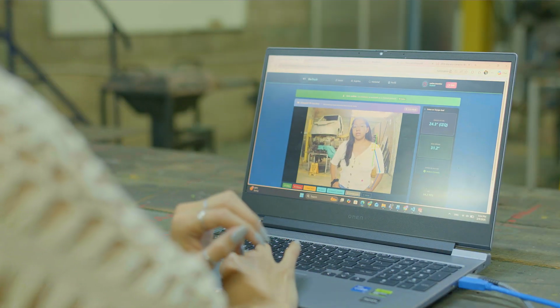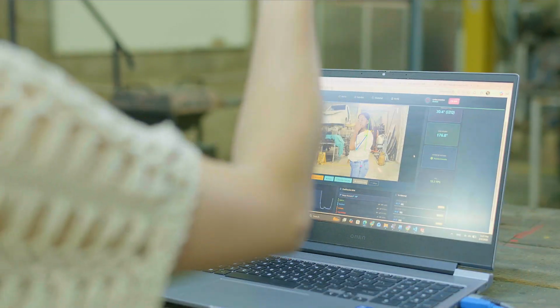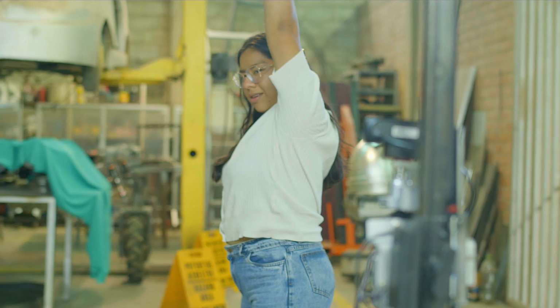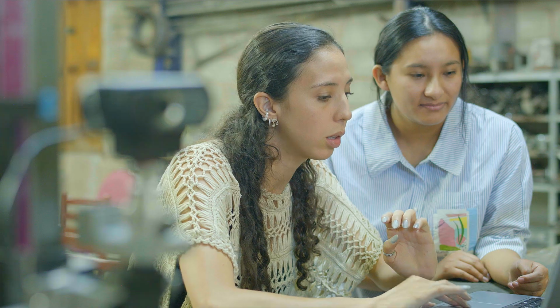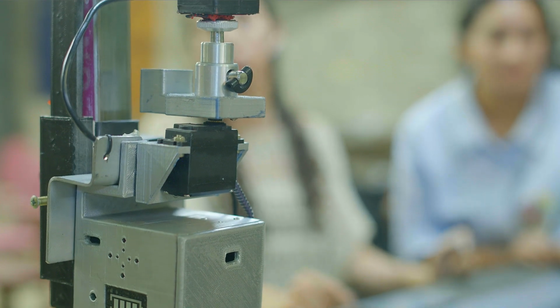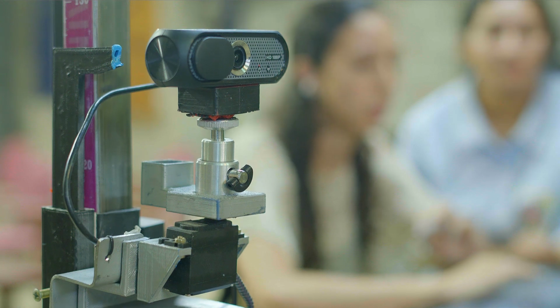With controlled geometry, the software estimates anatomical landmarks, calculates the angle in real time, and records the session to compare attempts and learn functional range of motion. On the computer, a Python backend runs using Flask, OpenCV, and MediaPipe Pose, while camera positioning is executed through an embedded closed-loop system.